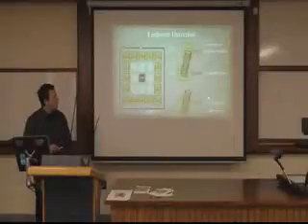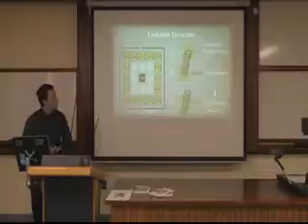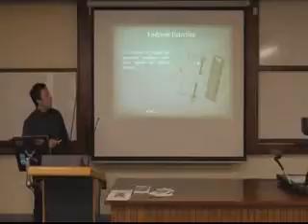And from that you can distinguish what are endpoints and what are not, because you get multi-sequences, and also sequences that are too long would represent non-detections. Endpoints have these kinds of consistencies. And through that, you can equate an orientation angle. So now we've got a possible candidate of an endpoint.